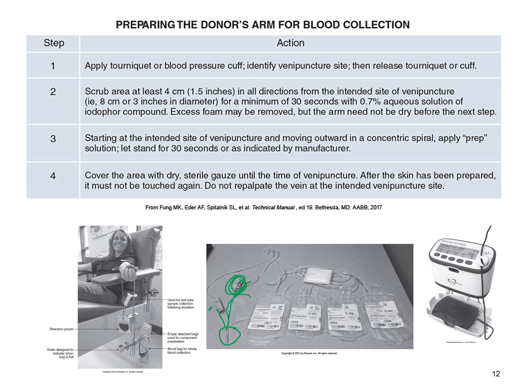What you see here is a little pouch that is used to do the sampling for testing, because we want to test what's actually going into the bag. Once it goes into the bag, we can't enter that bag because we could potentially contaminate it with some sort of bacteria or organism. So in order to prevent that, you have this little satellite bag that allows the blood to flow into this bag, and once that's filled up, they'll seal that off, and then they'll allow the blood to flow through this process and go into the overall larger collection bag.